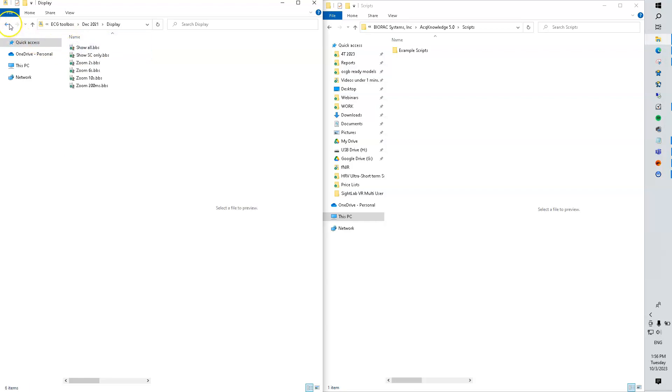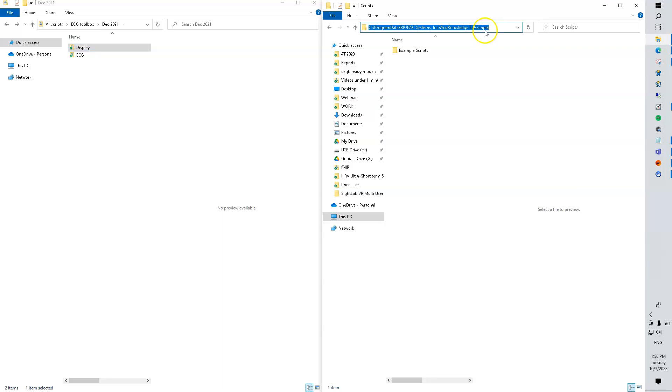Right here. We'll place them in this location. That's always the same location on the computer.